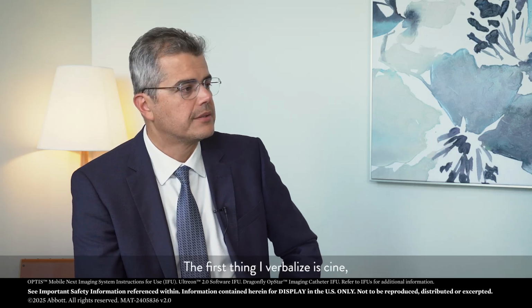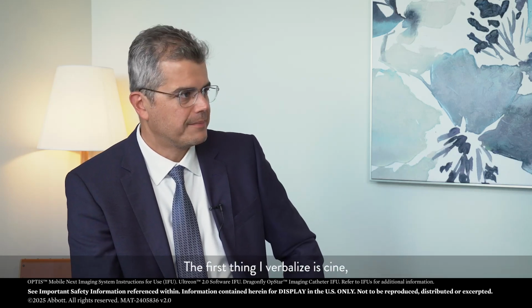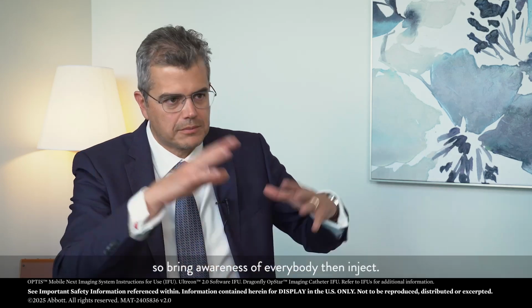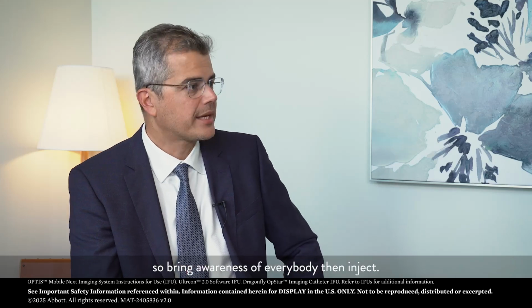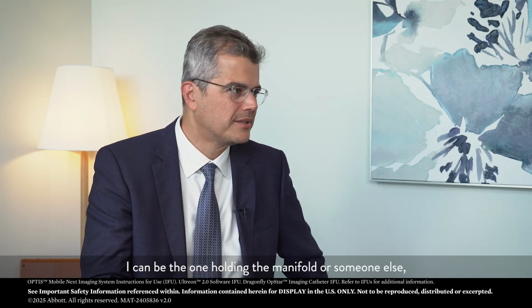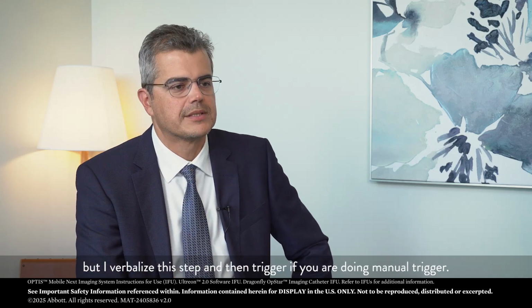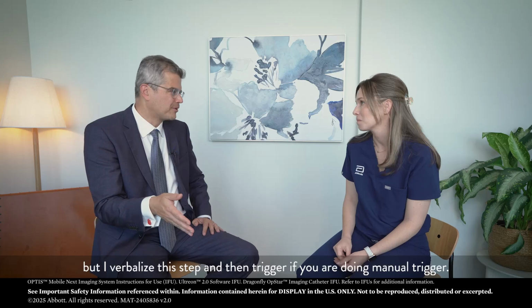The first thing I verbalize is cine, even if it's me stepping on the pedal. I say cine, so I bring awareness to everybody. Then inject. I can be the one holding the manifold or someone else, but I verbalize this step. And then trigger, if you are doing manual trigger.